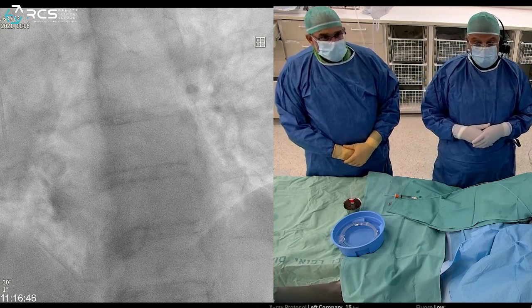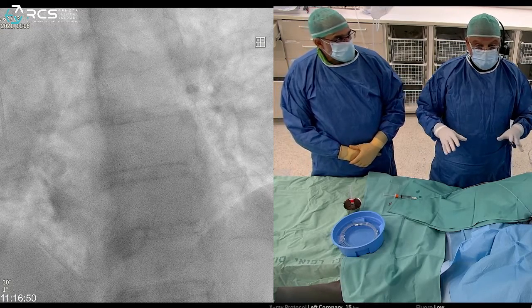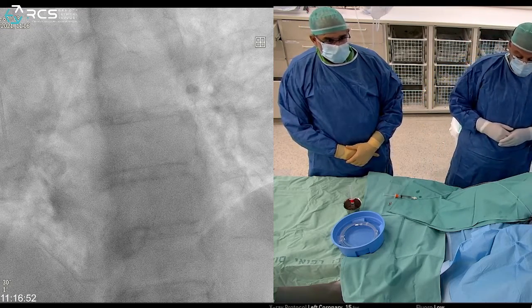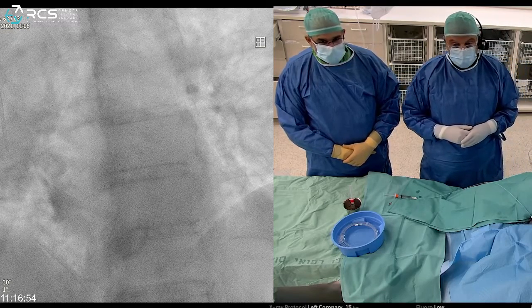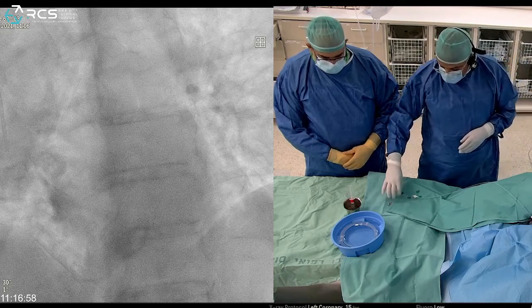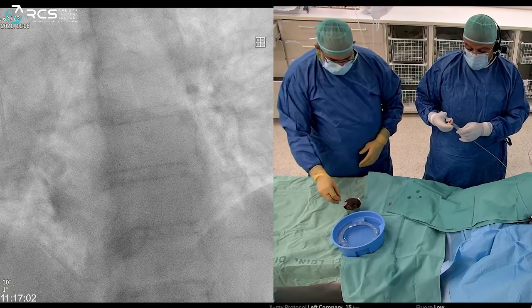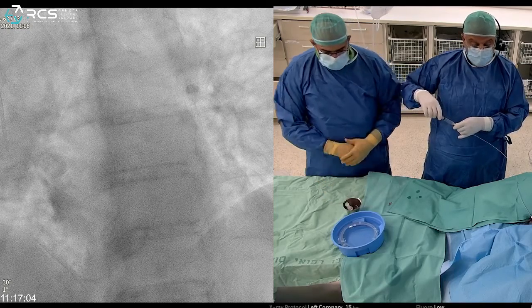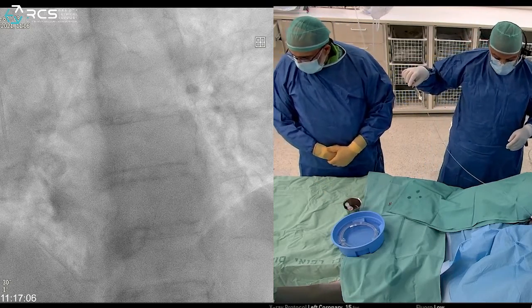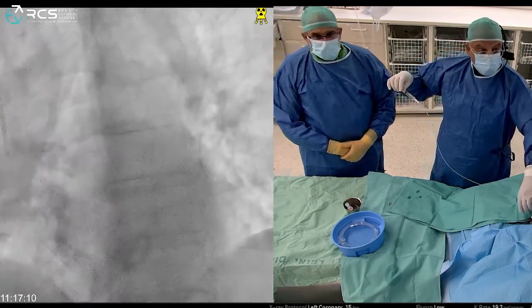If the mean pressure would have been 15 or higher we would abort the procedure, but since it was less than 15 we continue. The next step is to take a 10 ml Luer-lock syringe with full contrast, hook it up to the multi-purpose catheter, and try to engage the ostium of the coronary sinus.